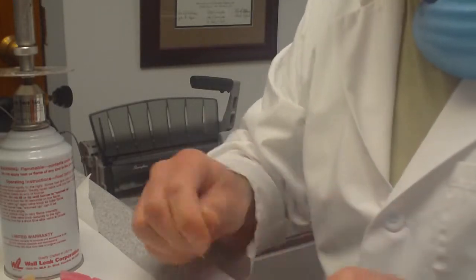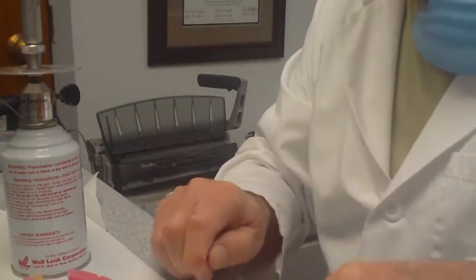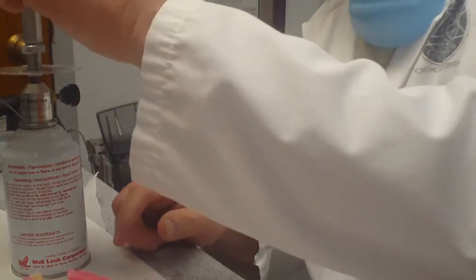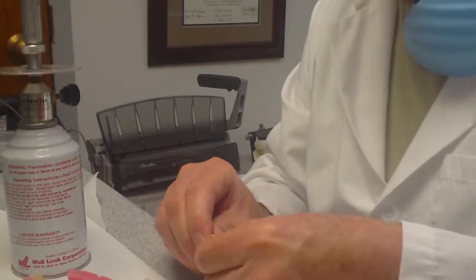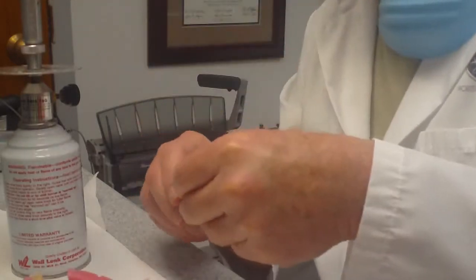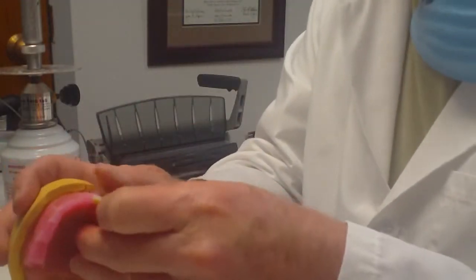This particular wax I'm using is relatively soft and sticky, and it has some advantages. There are also some disadvantages, but at least for what I'm doing at this point, there are some advantages because it's relatively easy, number one, to get it to adhere to the record base, and number two, to be able to move it back and forth.